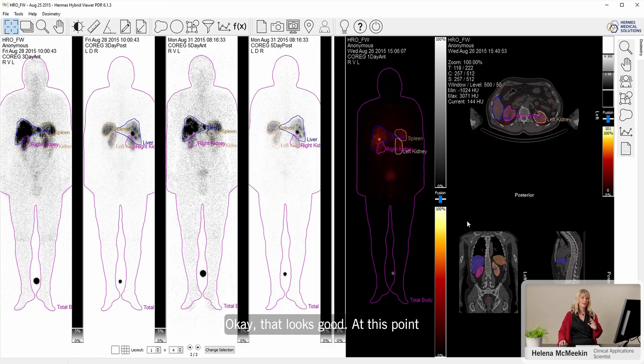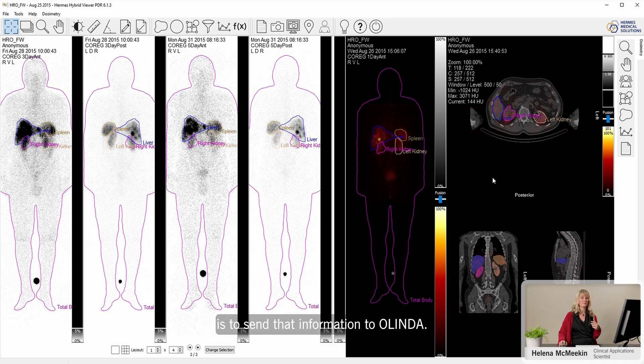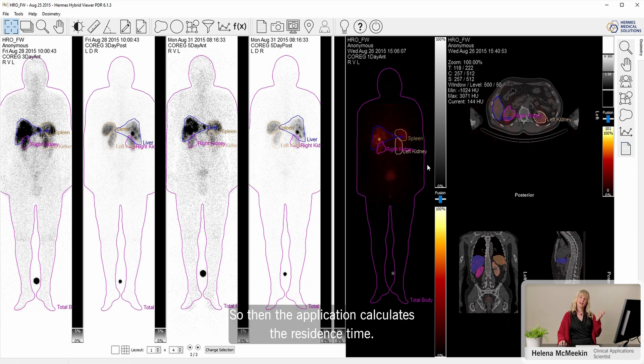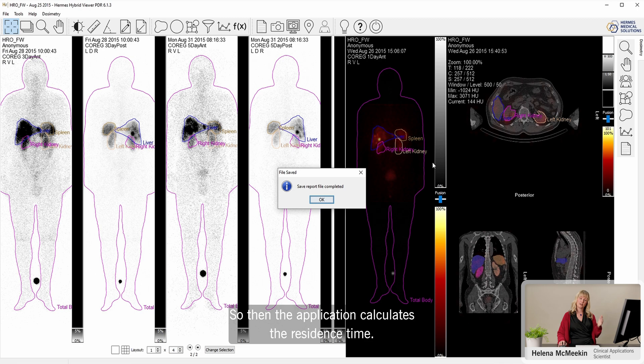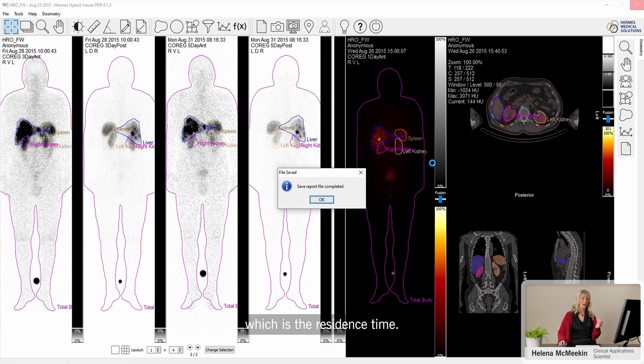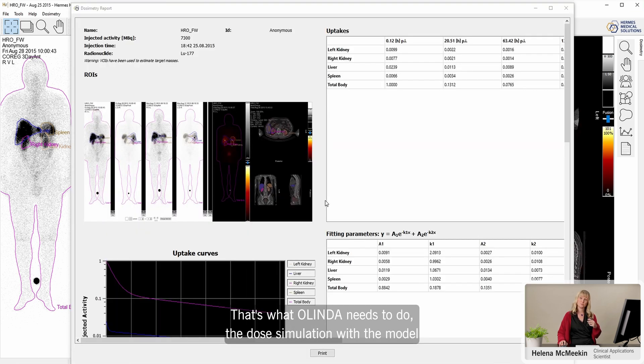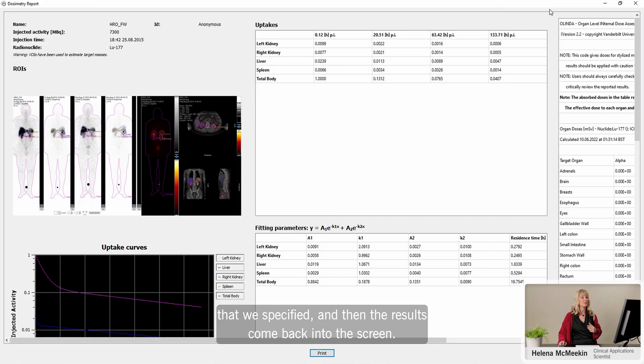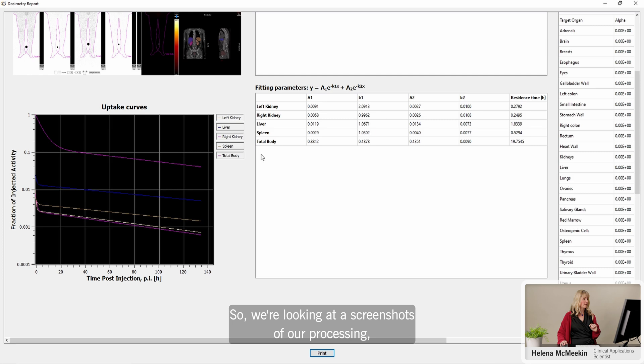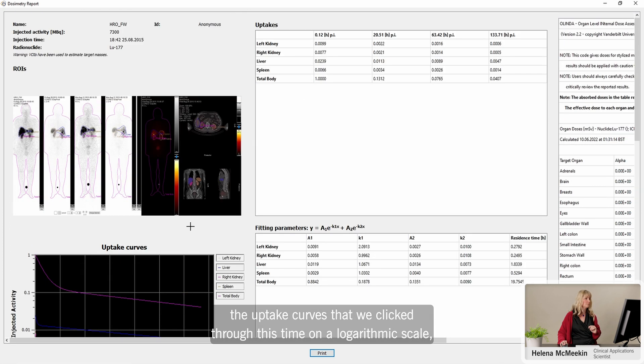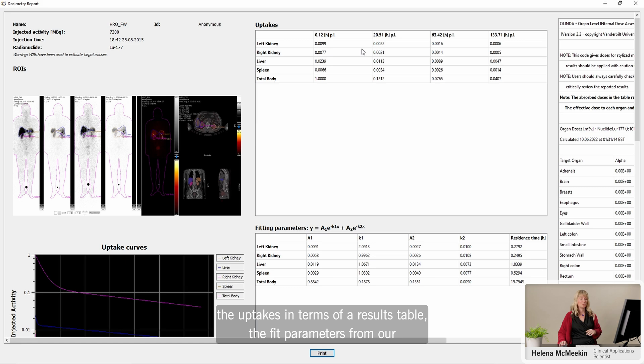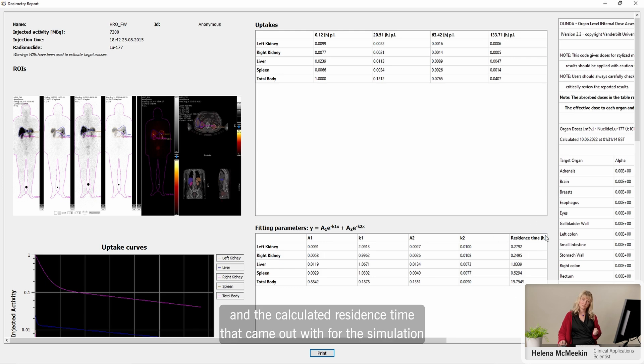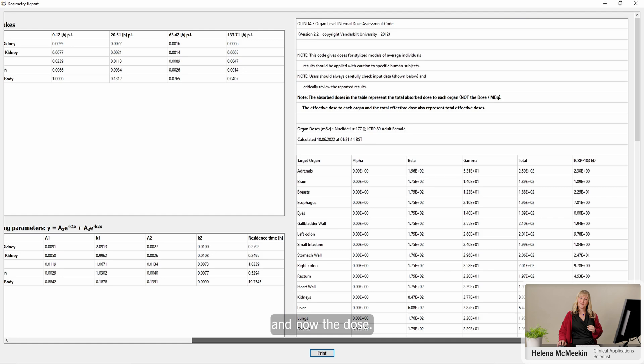That looks good. At this point, we've done all of the necessary prep work. The last step is just to send that information to Olinda. That's this button here, results. Then the application calculates the residence time. It uses those fits, calculates the area under the curve there, which is the residence time. That's what Olinda needs to do the dose simulation with the model that we specified, and then the results come back into the screen. We're looking at a screenshot of our processing, the uptake curves that we clicked through this time on a logarithmic scale, the uptakes in terms of a results table, the fit parameters from our bi-exponential fit, and the calculated residence time that came out for the simulation.